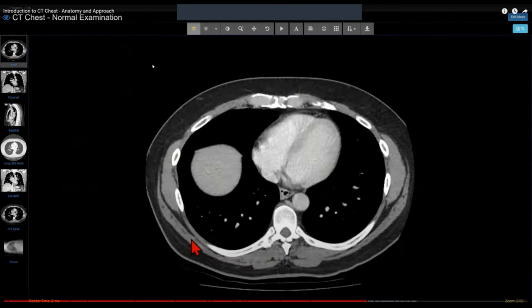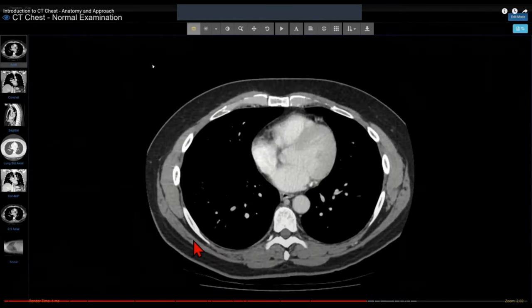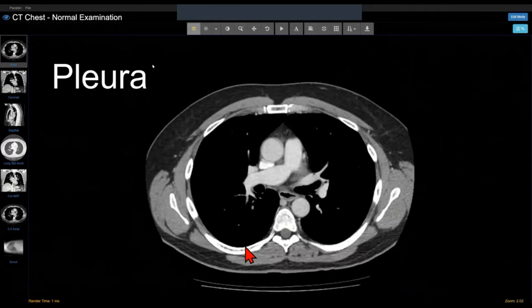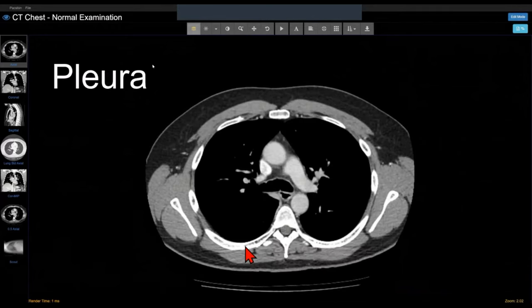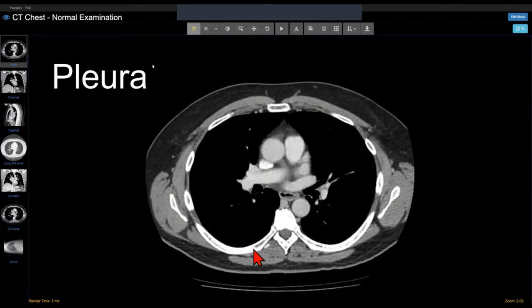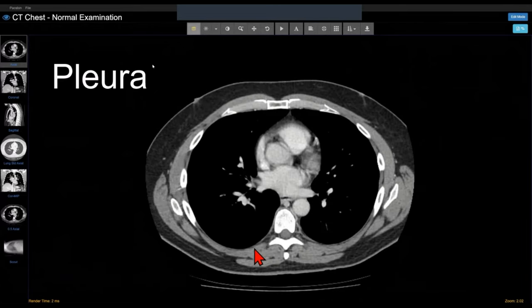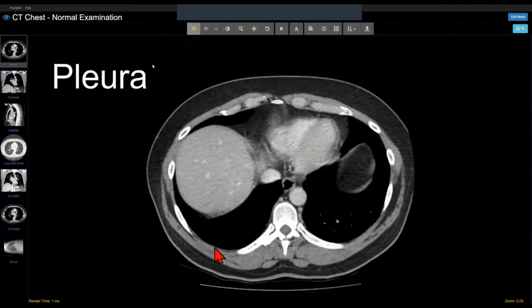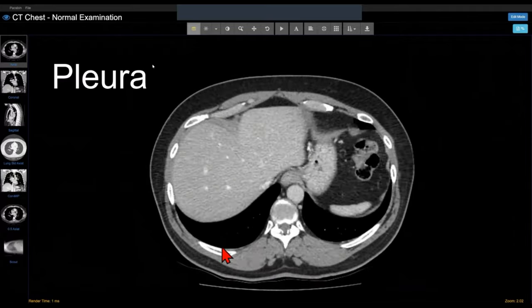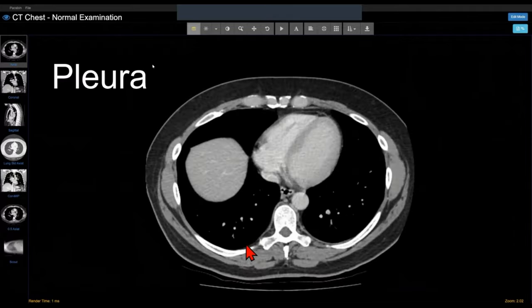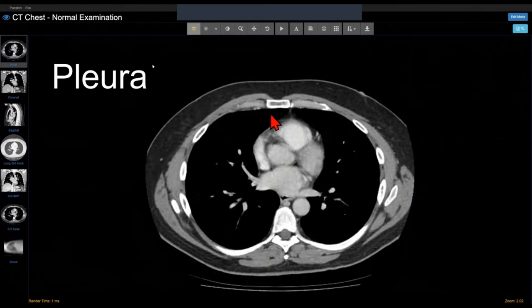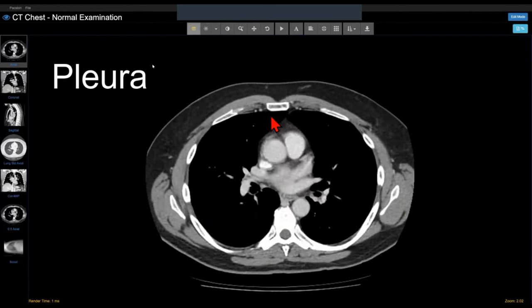Surrounding each lung is a double layer of pleura — you don't see normal pleura on CT. The space between these layers is the pleural space, where you'll look for pleural effusions filling dependently, and gas in pneumothorax.